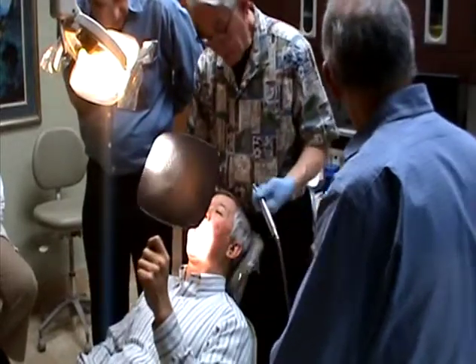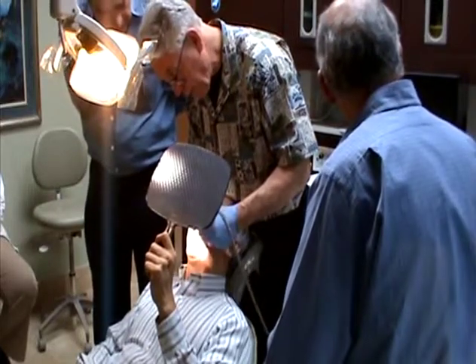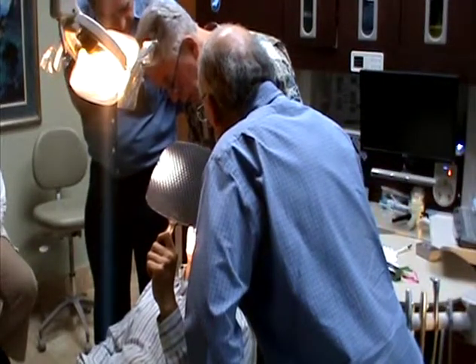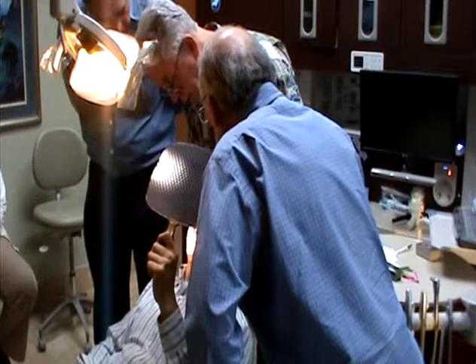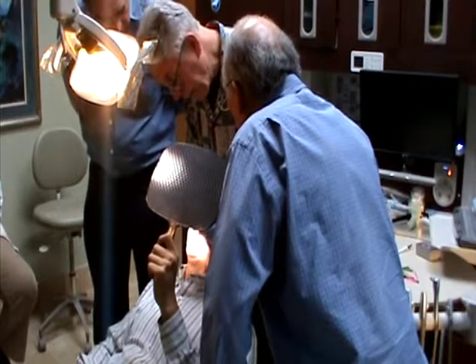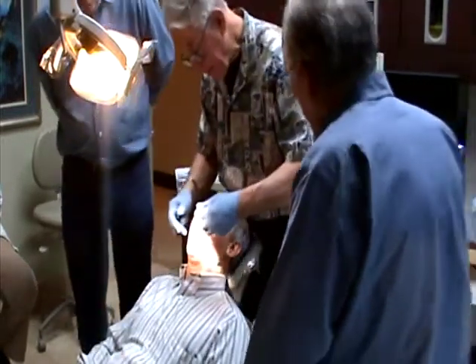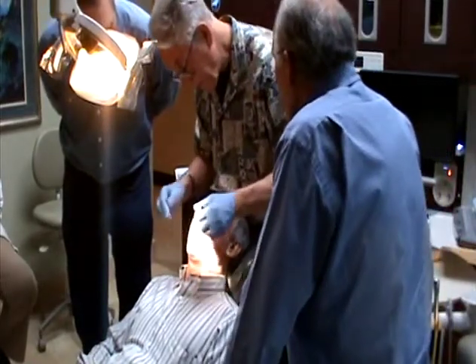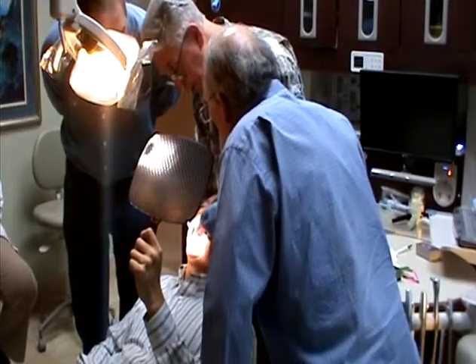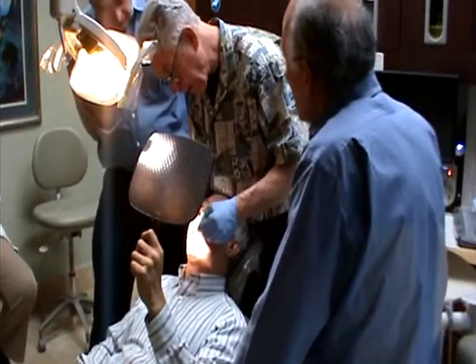Now we're getting better cuspid disclusions. See the cuspid's coming in more here, and these are getting darker. And this one just doesn't like that group function, especially. He's just on a roller there, he didn't like that. Now we got that a lot better. You got most of this group function off of here. See how this is hitting now? It wasn't hardly hitting before. Now he's got his cuspid involved there.